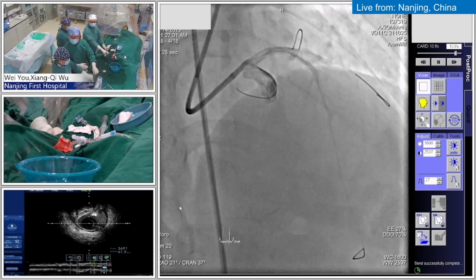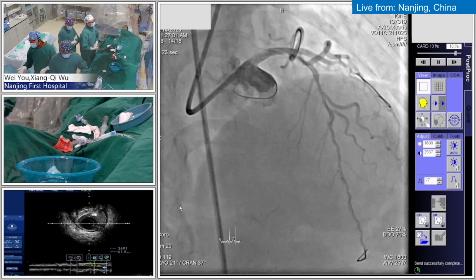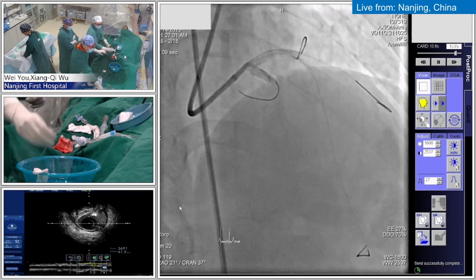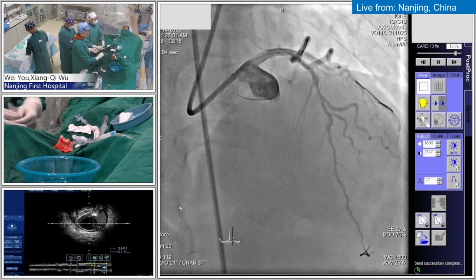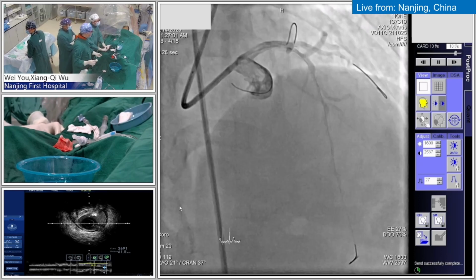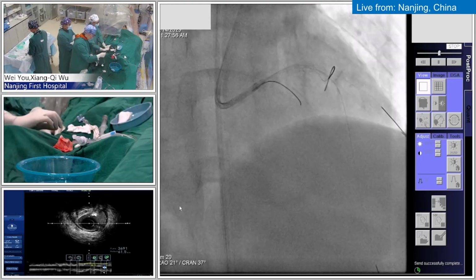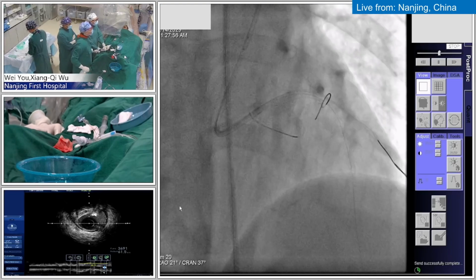4.0 balloon. Chinese. So over the last several years, I'm sure for all sorts of reasons, you're using more and more of the Chinese equipment. Yeah, right. So tell me more about which are some of the biggest Chinese companies. MicroPort? MicroPort, yes, we have heard a lot about it. Excellent company, a very expanded range of products. Are they also in structural heart? Yeah, structural heart. And we have Chinese domestic valves. Yes, I have known about the Venus valves, but Venus may be the first TAVR device.